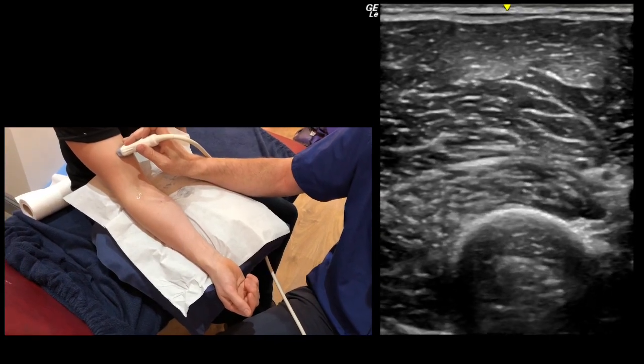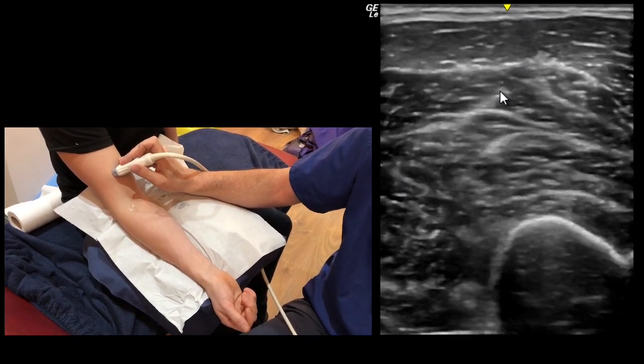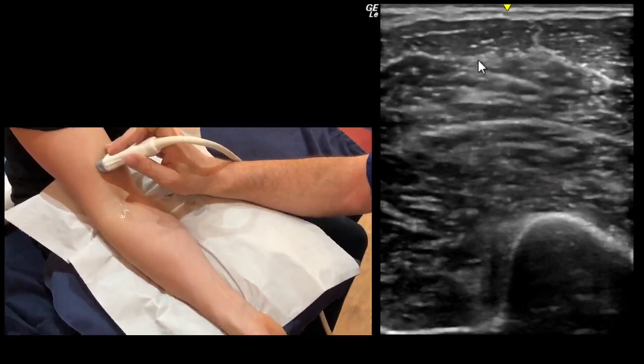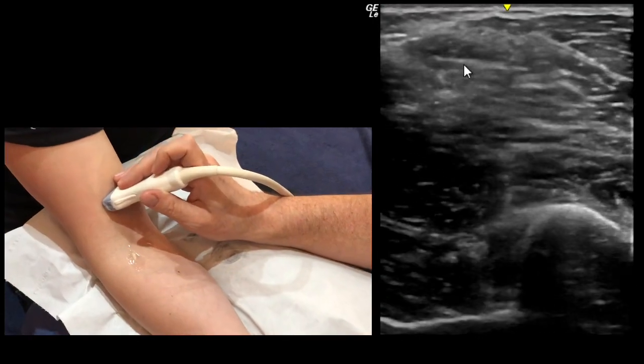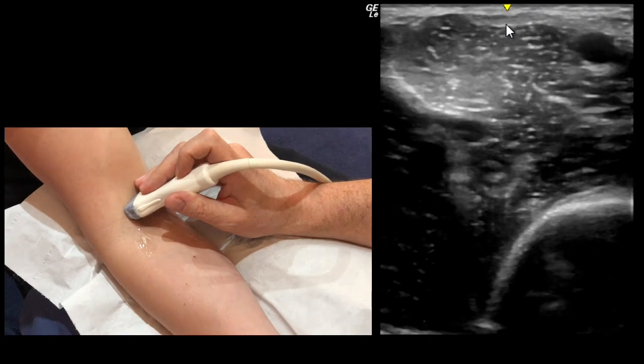A short axis view of the distal biceps. We're looking at the biceps muscle here, coming down as it forms a tendon. The tendon forms an aponeurosis that forms up in the middle of the muscle and coalesces at the top of the image here.